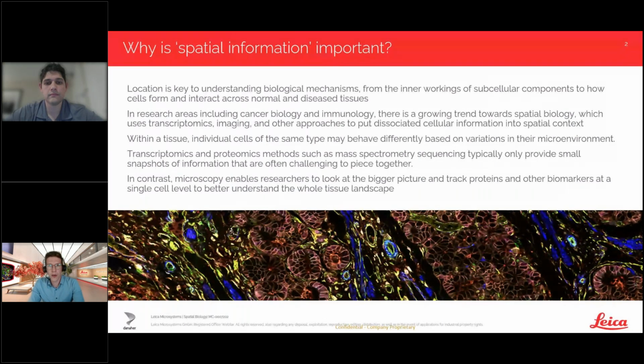And this helps you then, of course, to go beyond, let's say, a small snapshot that you can normally get with other methods like transcriptomics, proteomics, mass spectrometry, and others, which give you a lot of information, but which is either averaged out, let's say, over whole tissue, or which is just one point in time. And in microscopy, we can put all this now into context of the whole tissue. We can provide the manual, so to say, for your Lego, which then helps you to create the bigger picture.